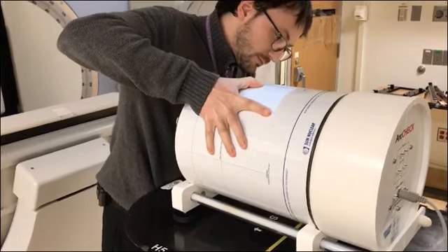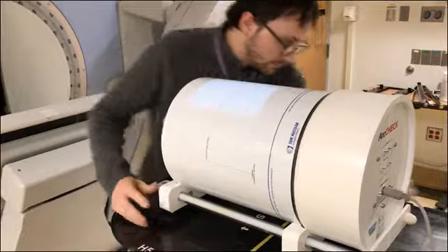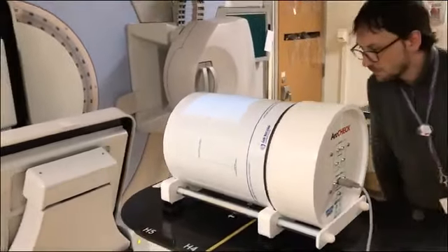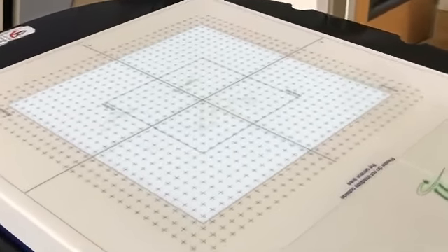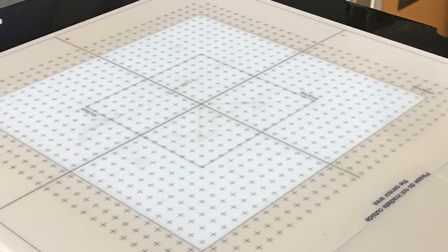So now I'd like to talk about some of the devices that are used to make these measurements. So I showed you this one, the cylinder. I'm going to mention some vendor devices here. I don't really have any particular favorites. This one is an array of ionization chambers. It's a flat array. Distance between chambers is 7.6 millimeters.